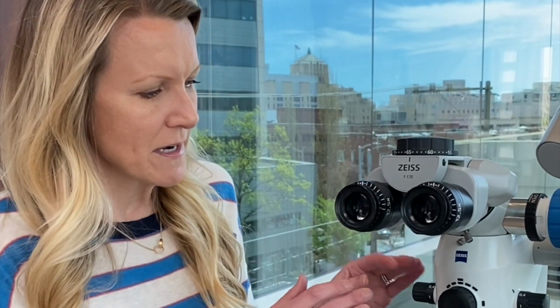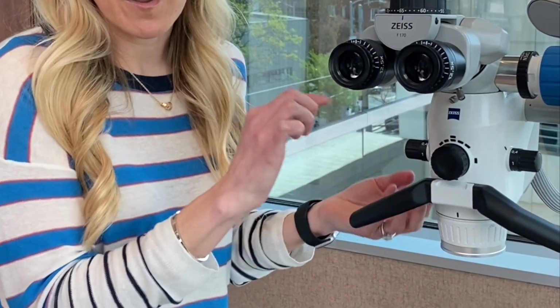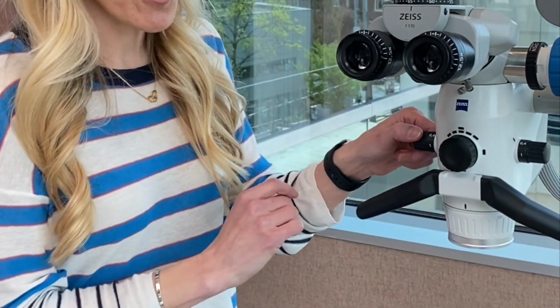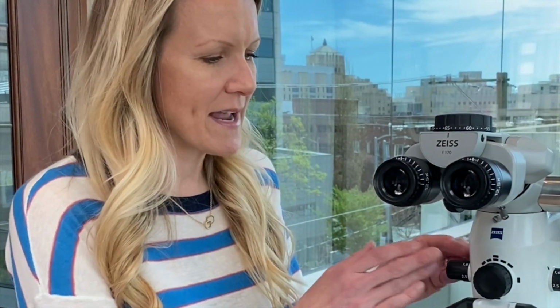It's not like 4 times, 8 times, 12 times. It's a calculation that I will go through in a different video in terms of how to record that and how to measure that. But that's how you change your magnification and step it up. Essentially, there is a series of lenses on the inside of this scope body on a turret that, as you're turning this knob, is rotating the lenses so that you can change that magnification step. Many scopes today, this is motorized, and this can just be done by using a foot switch.